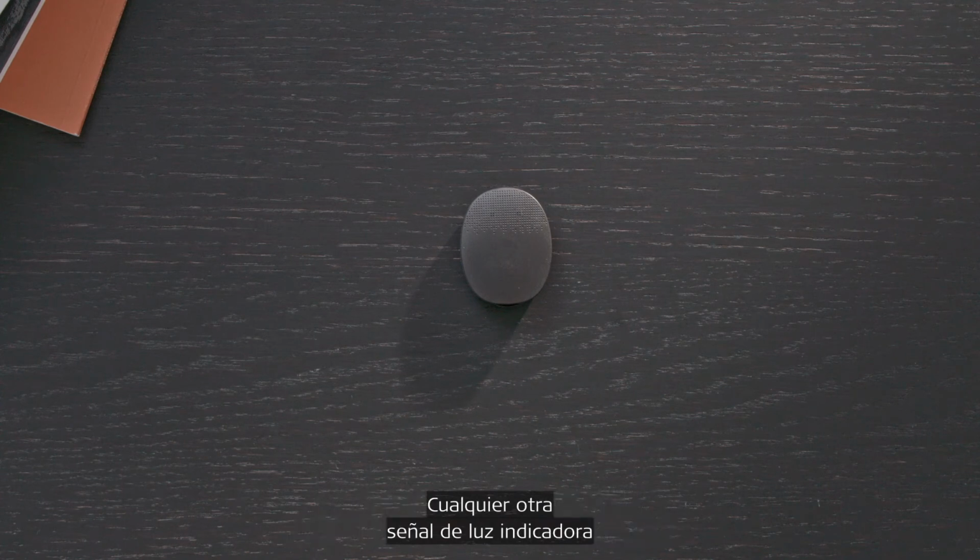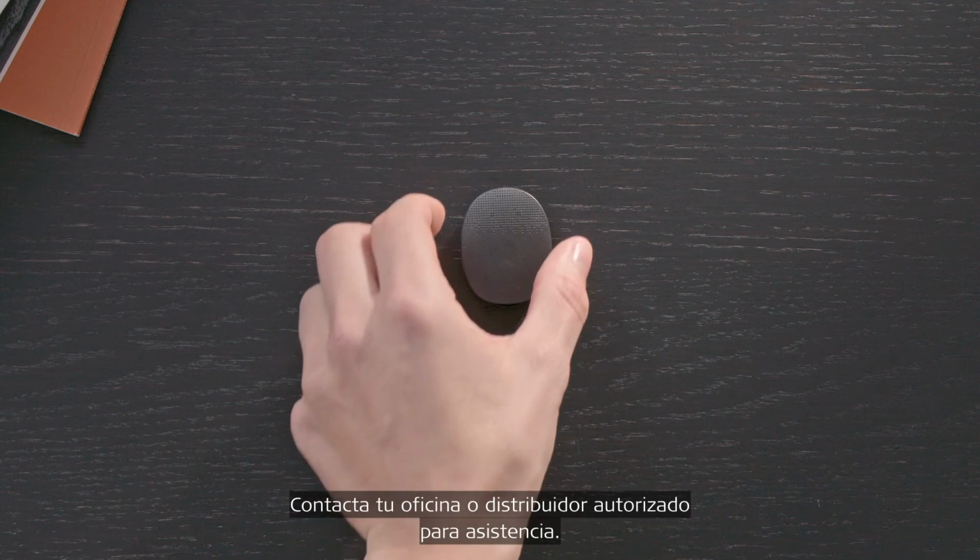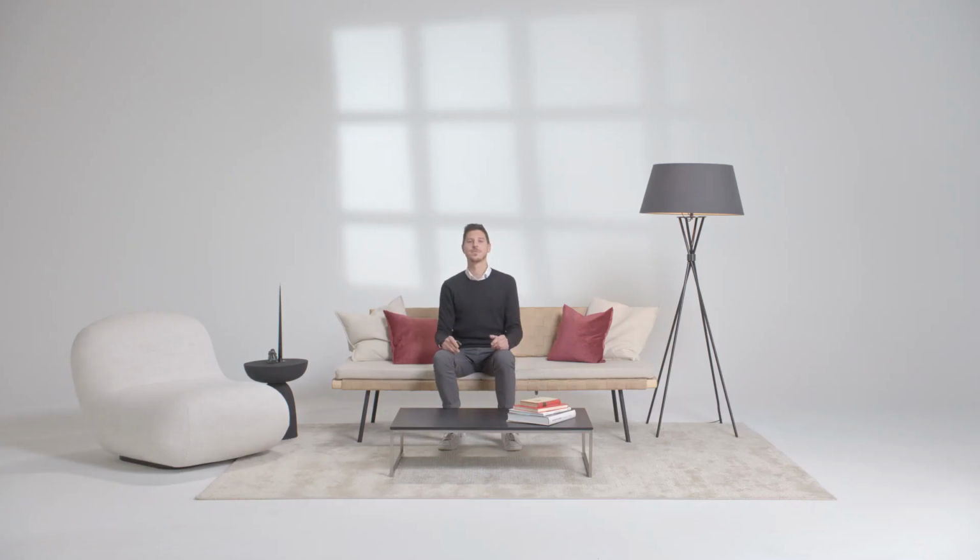Any other indicator light signals suggest that there may be a technical issue with your Rondo 3. Contact your CI center for further assistance. And that's it.